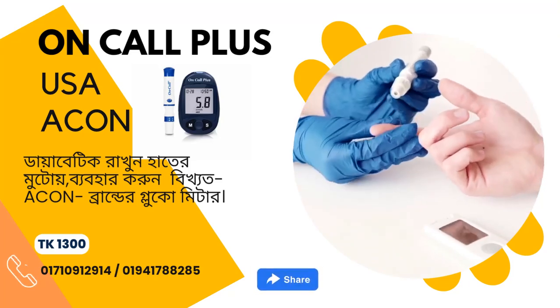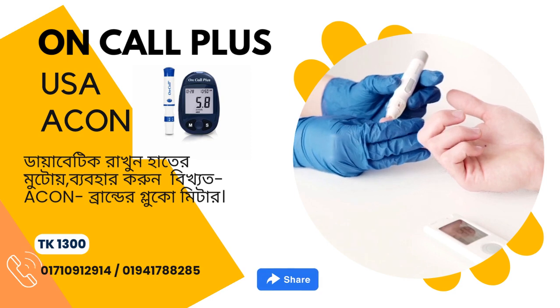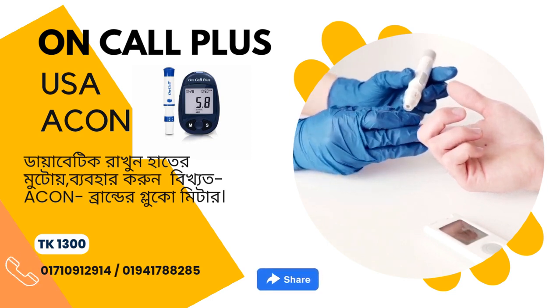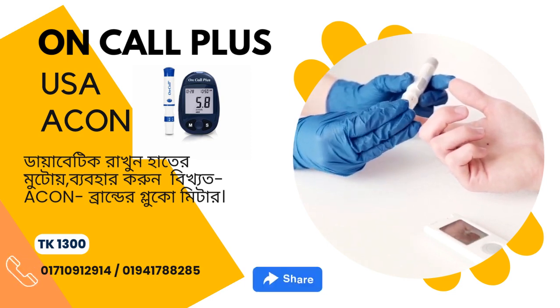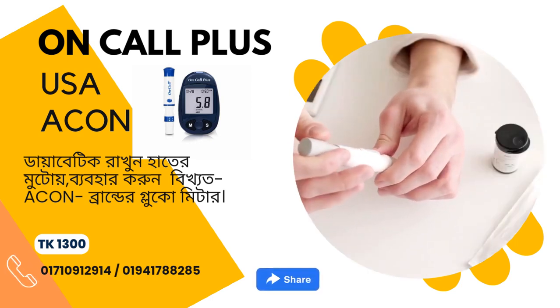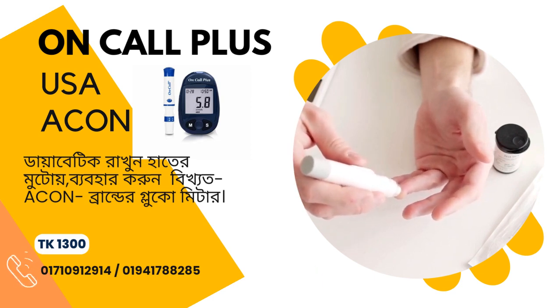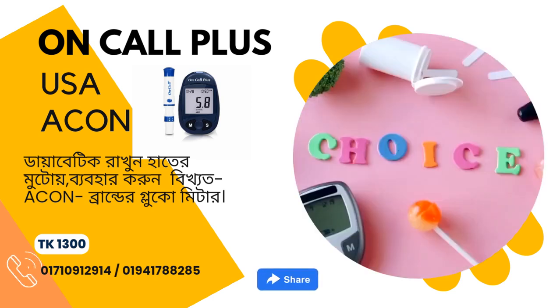On-Call Plus Blood Glucose Test Meter. This On-Call Plus blood glucose monitoring system is one of the most affordable blood glucose monitoring meters in the market today. It is capable of storing up to 300 test memory with date and time, as well as showing averages over the last 7, 14, and 30-day periods. It is a reliable blood sugar monitoring system that delivers accurate results in 10 seconds.